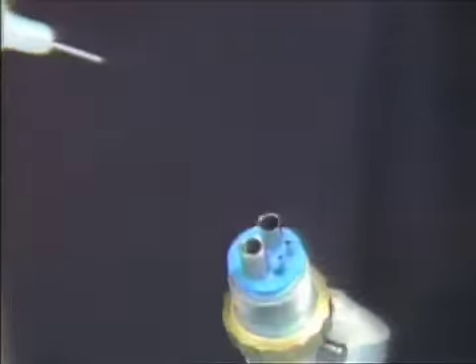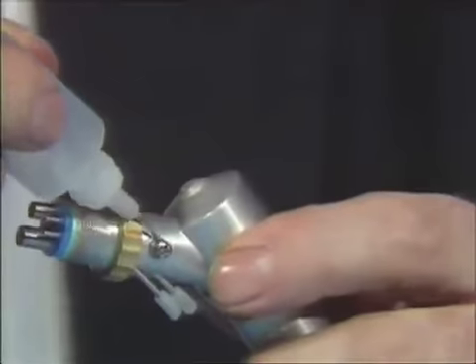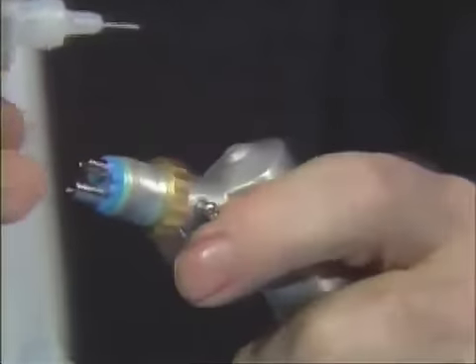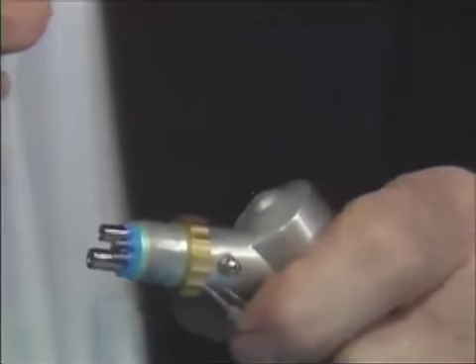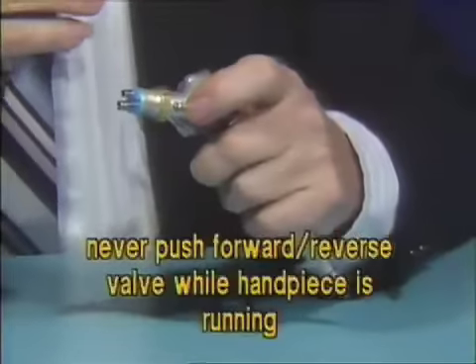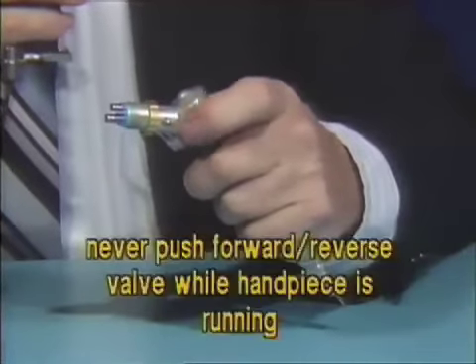The next portion is the forward and reverse valve. Apply one drop on each side of the forward and reverse valve, then move it several times so it will be free. Never push the forward and reverse valve while the handpiece is running.